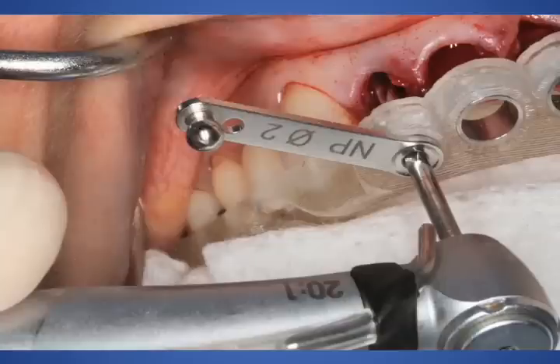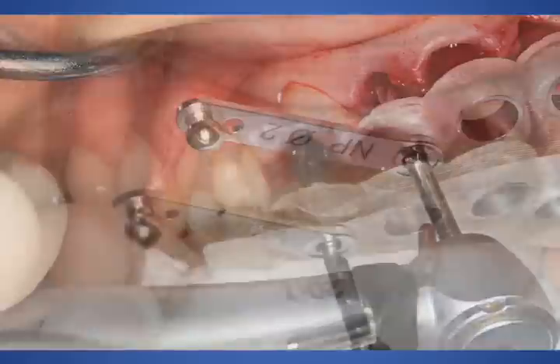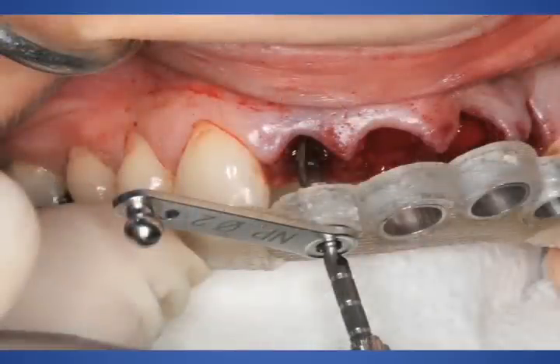So here we're simply placing a 2mm key into our 3.5 millimeter ring, and we're going to use our 2mm drill, initiating drill or pilot drill, to make our initial osteotomy. Now we've also predetermined depth of all of our implants, so we know exactly how deep we want each of the implants to be. We know their depth and their width precisely. It's a very precise system. You can see that the initiating drill or the pilot drill has markings on them.